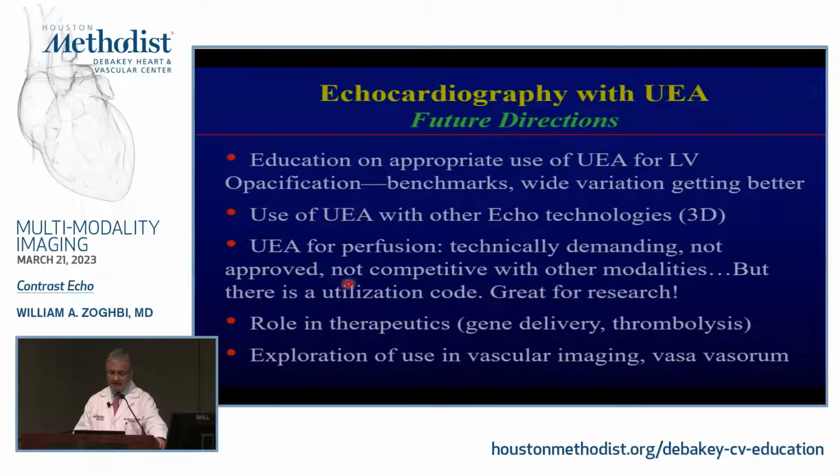It is technically demanding, not approved for perfusion still, not competitive nowadays with other modalities that we have, and we have quite a few. And although there is a utilization code, it is really great for research, no question about it, particularly animal work.